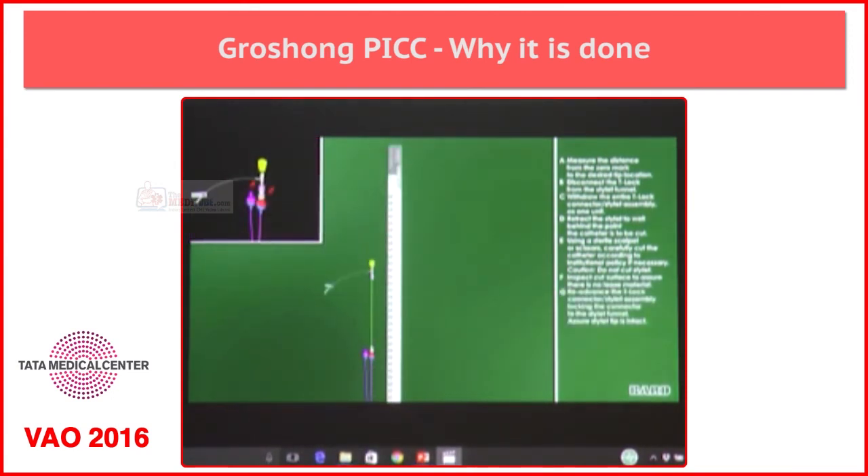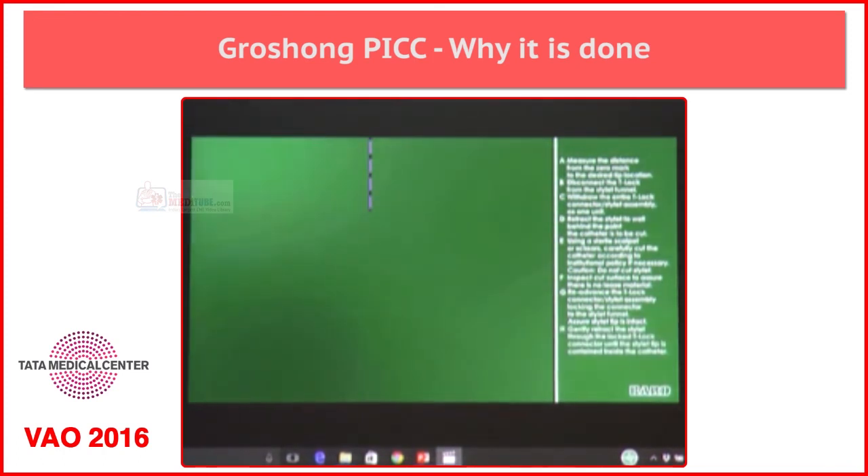The stilet then needs to be advanced forward till the tip — the new tip which we have created.